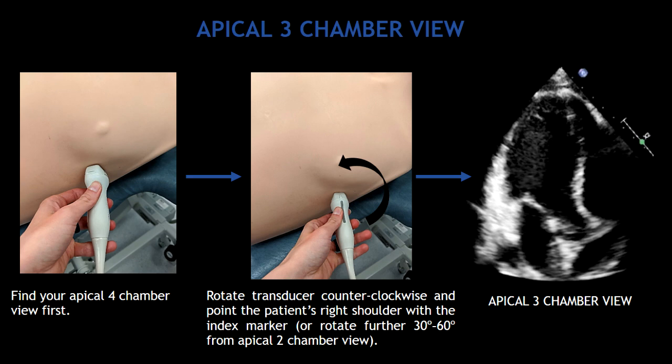And the last one is the apical three-chamber view. You can use two techniques to obtain this view. Either you find your four-chamber view first and rotate the probe counterclockwise until the index marker is pointing to the patient's right shoulder, or find your apical two-chamber view and rotate the probe counterclockwise between 30 and 60 degrees. The index marker has to be pointing to the patient's right shoulder. Either way, you can obtain the apical three-chamber view.